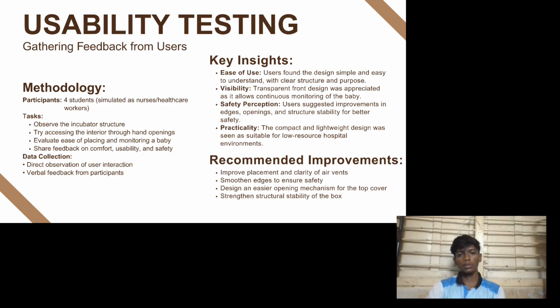Next, we need to smoothen the edges to avoid any injuries. Then we should make the top cover easier to open so handling becomes simple. And finally, we need to strengthen the structure so the incubator becomes more stable. Now to conclude, usability testing helps us understand real user problems and improve the design. It ensures that the product is not only functional but also safe and easy to use.